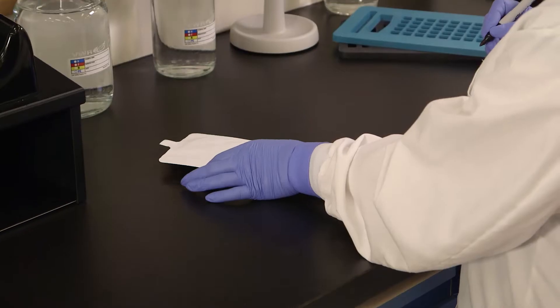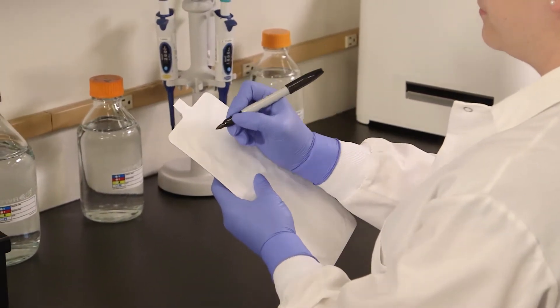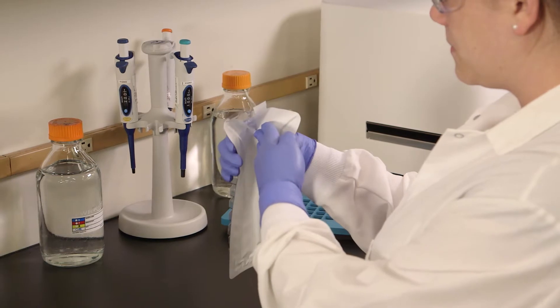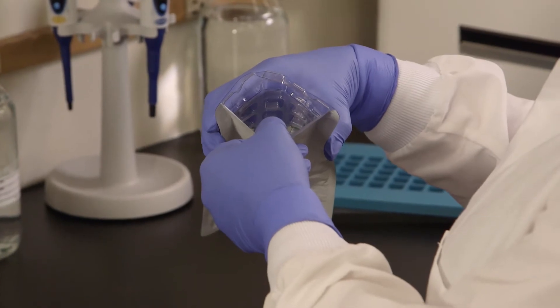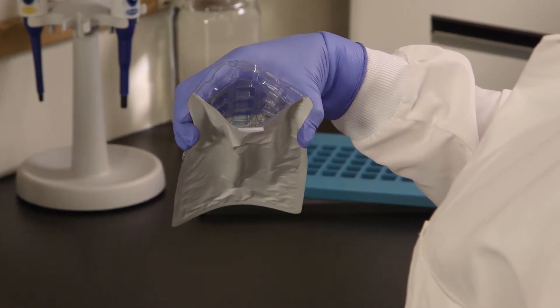Use only a permanent felt-tipped marker to label the Quantitray. Adhesive labels may adhere to the sealer roller and ballpoint pens may puncture the paper. Hold the Quantitray at the top with the well side facing your palm. Push the top edge of the Quantitray in with your free hand while squeezing the tray into a circle. Open the Quantitray by gently pulling the foil tab away from the plastic side. Be careful not to tear the tab. Do not touch the inside of the tray.